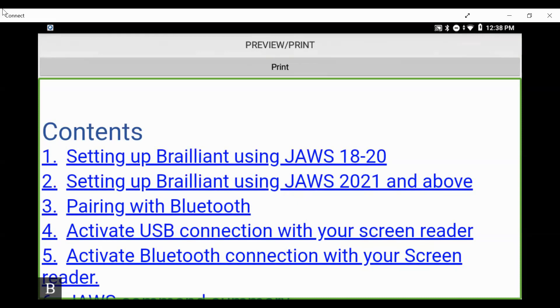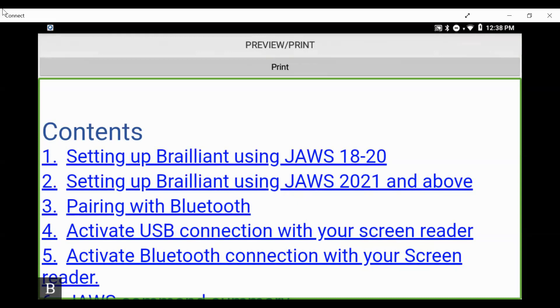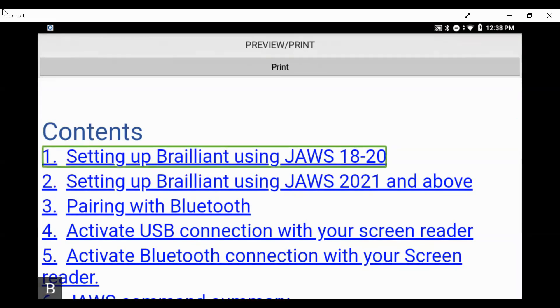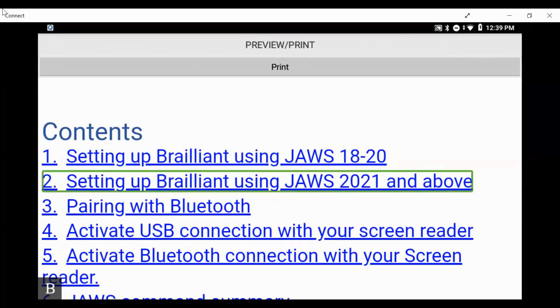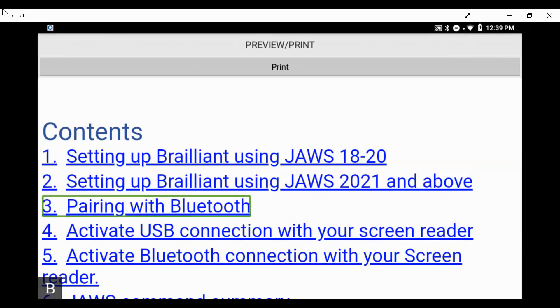Using my spacebar or next thumb key to read down line by line, we hear 'Contents' and the first item: 'Setting up Brailliant using JAWS 18–20, link.' The first item in the table of contents is a link. Pressing my next thumb key: 'Setting up Brailliant using JAWS 2021 and above, link' — also a link. If I press L I will move to the next link in the document: 'Three, pairing with Bluetooth, link' — and so on.